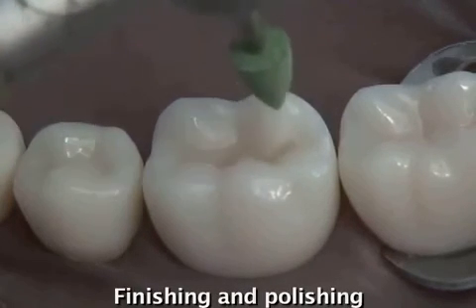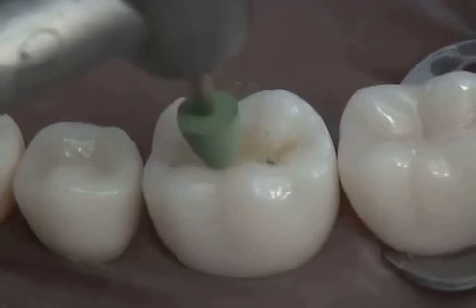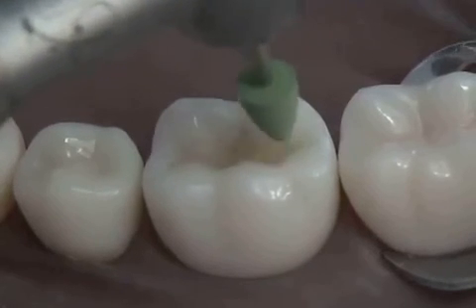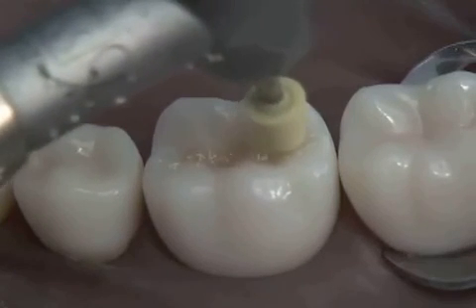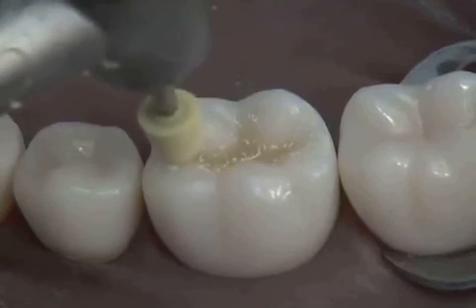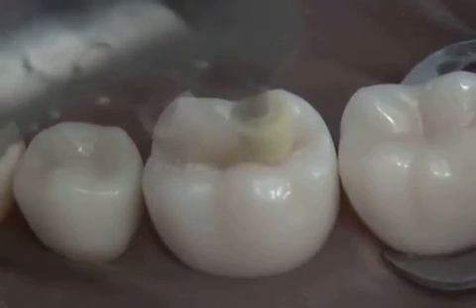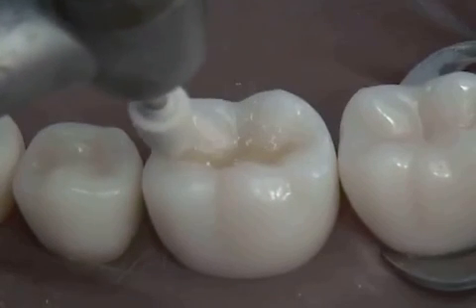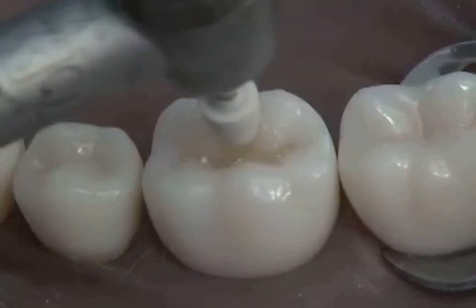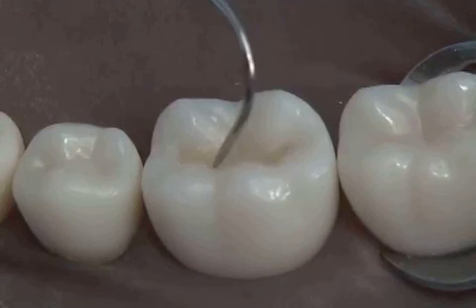Finally, you can finish and polish the restoration with a silicone impregnated rubber polishing point. Green to yellow and then to white is the typical coarse to fine Jiffy polishing system. You can check one last time for flash, of course after confirming that the occlusion is satisfactory for the patient.